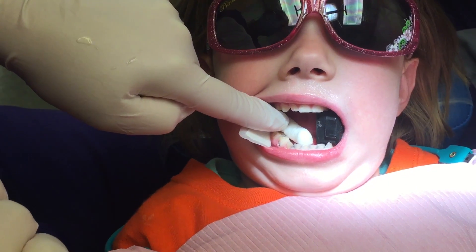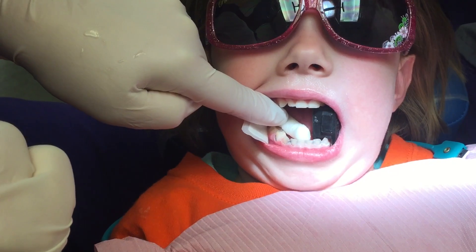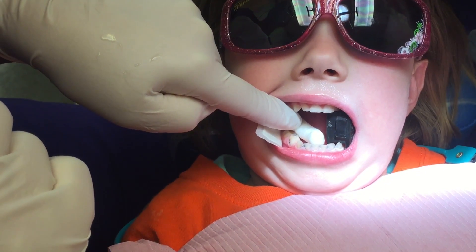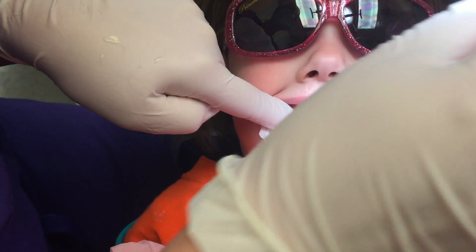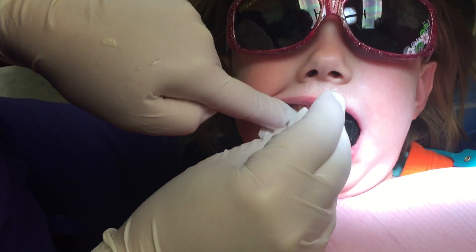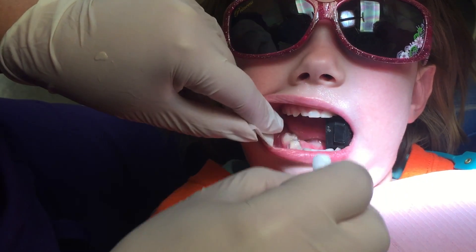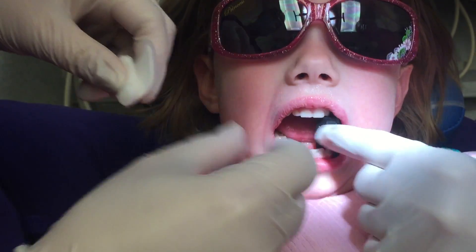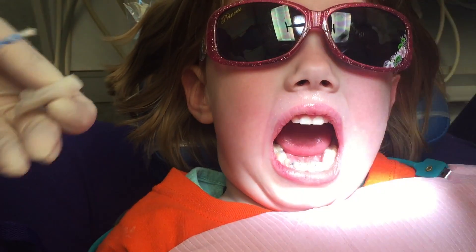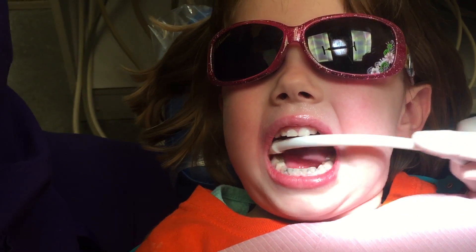All right, it's done. I'll take the varnish, I'll just cover it, and then we're done. You're amazing — was that easy, honey? Not too bad? Easy peasy lemon squeezy! You want to spit in our little straw? Good, good. Thank you!